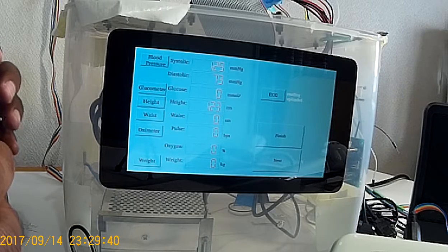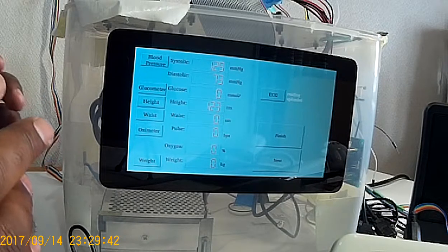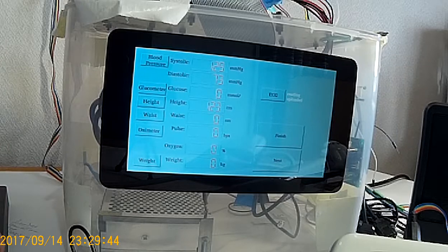A user has been logged onto the EHealth kiosk and did that measurement. So in that way, data can be gathered and compiled into a kind of record that will be personalized for a specific user.